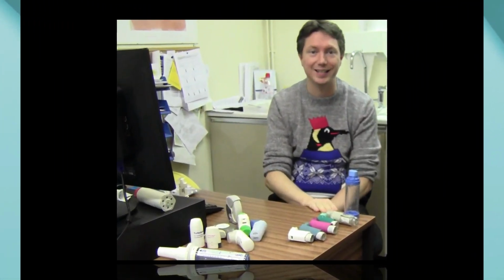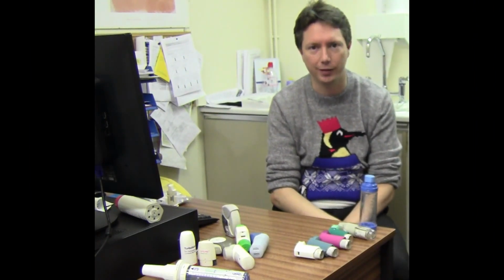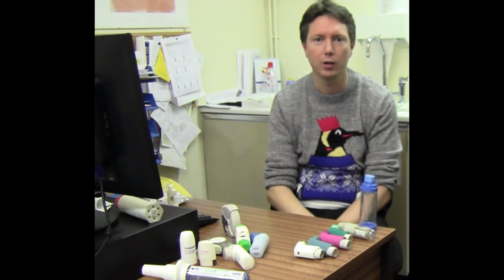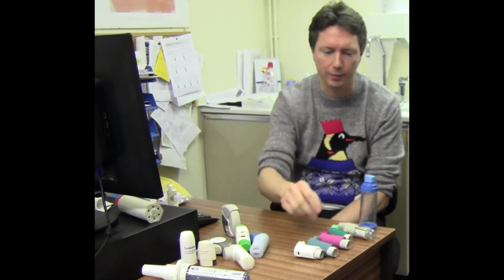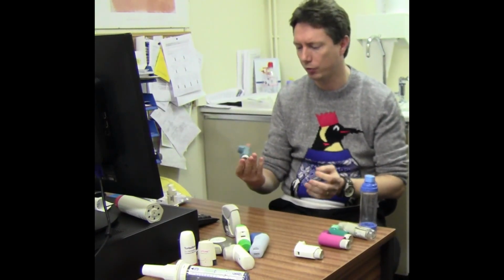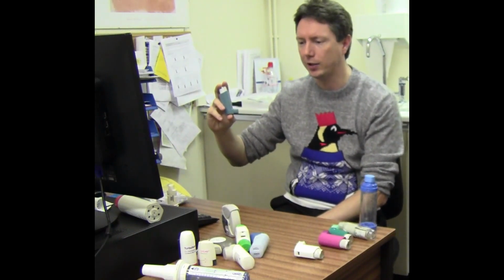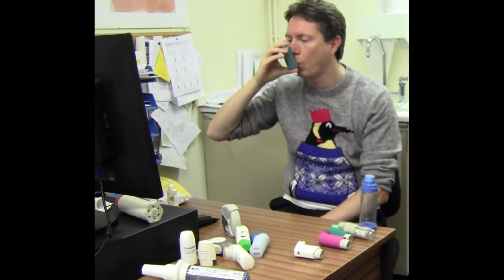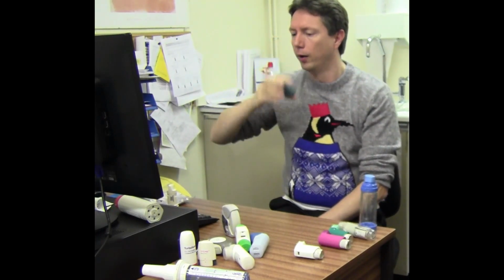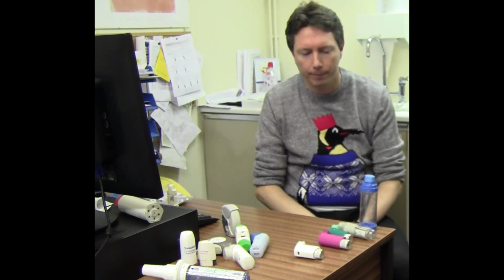Metered dose inhalers tend to contain gases, so what we need to do is help the patient to encourage the gas down into their lungs with a long, slow, gentle breath. This involves much harder coordination sometimes, but if I just demonstrate how we do it, you set off the inhaler, ready to go, expire. A very long, slow, gentle inspiratory flow there.